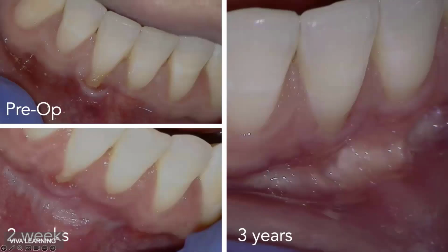One quick question that came on. What are the post-op care instructions? I usually send them home with either chlorhexidine, or if they don't want that, salt water. It is a little sore, but I'm not sending them home with any narcotics of any kind. And then they will do some exercises where they push their tongue down in there to keep it away. I've tried perio pack and stuff like that. It doesn't really help. It just gets in the way. So just have them stick their tongue down in there a few times a day to push on that.